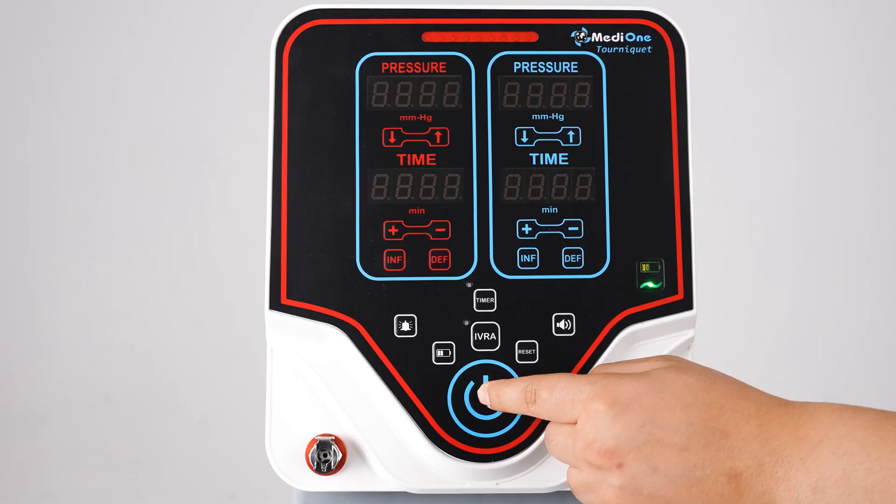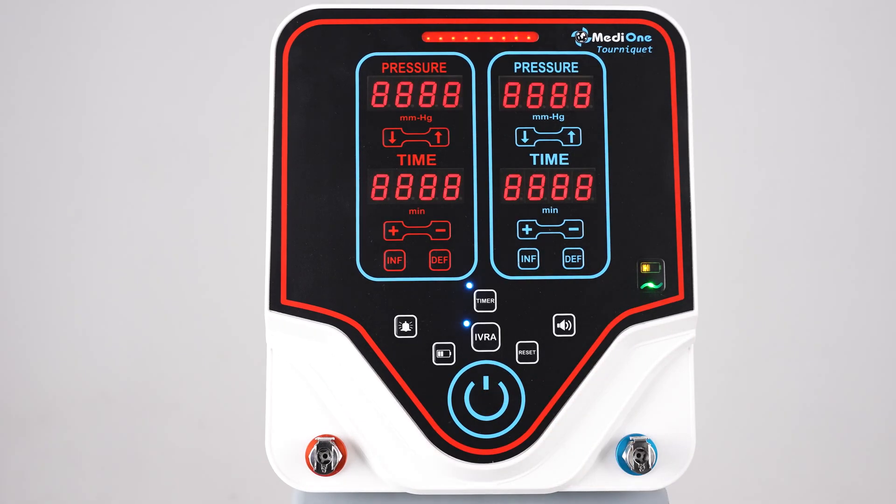Press the power button on the membrane for two seconds to turn on the device. The device automatically performs software and hardware self-checks at every boot. Make sure that the hoses are not connected to the device while the device is turned on. The screen consists of two parts.